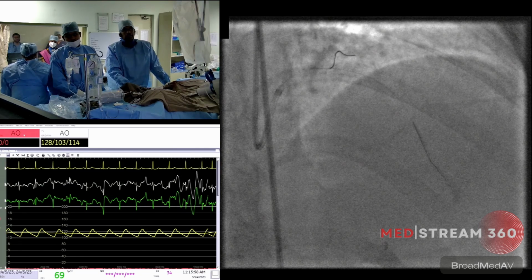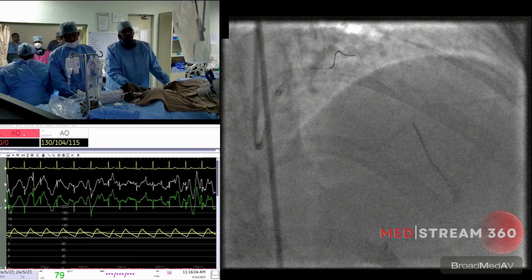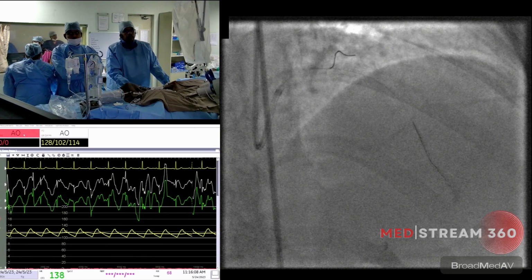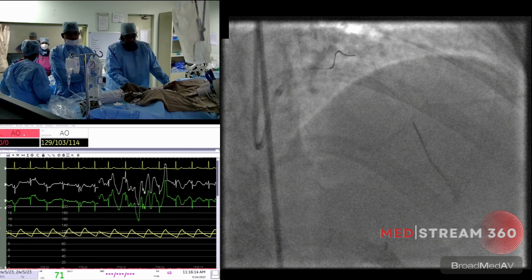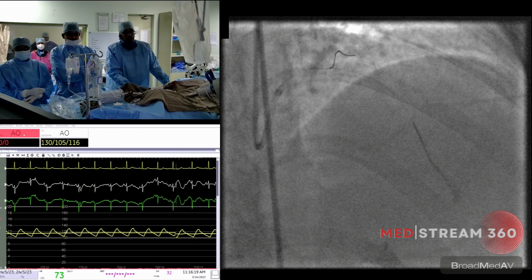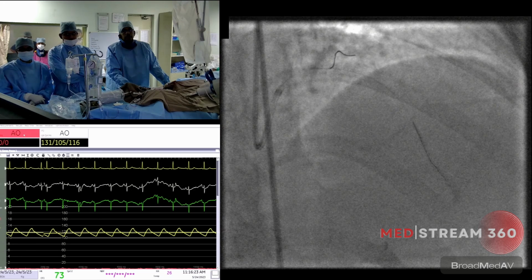So what are the things as we pull back, Nanda, you're going to look at? So I think I'm going to look at the distal edge for any distal edge dissection and the expansion. Then coming to the lesion area, I'm happy with 80% expansion in this particular case. And I'm going to look at the diagonal ostium, how it looks, whether there is any flow limiting dissection or not. And the proximal edge, how it is expanded.